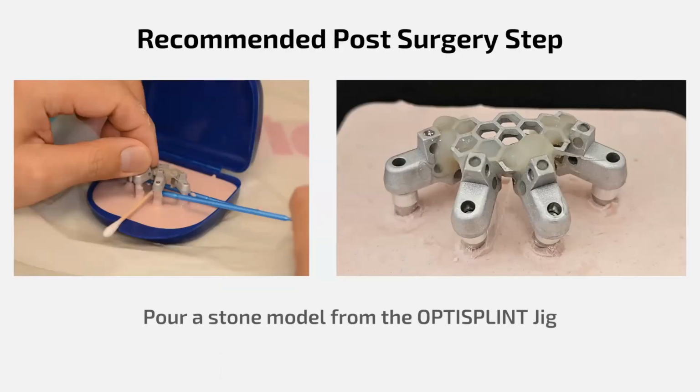And of course, we absolutely recommend pouring a stone model from the OptiSplint jig. It gives you a nice little tool that you can use if you're printing directly to the MUA. We all know that printing is not necessarily always the most accurate way of producing a prosthesis for your patients, especially if you're printing directly. If you want it to be as perfectly passive as possible, you can use this stone model to cure your prints, and then you're going to ensure you get the most accurate prosthesis you could probably get direct to MUA with that stone model.